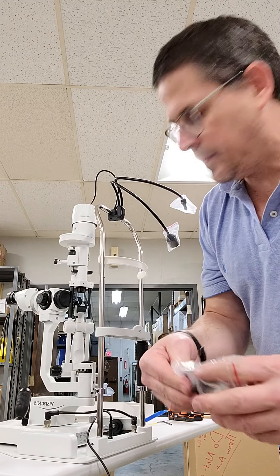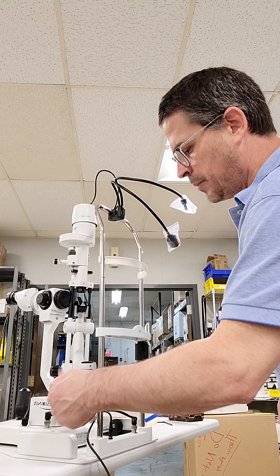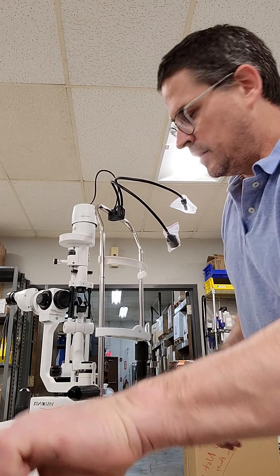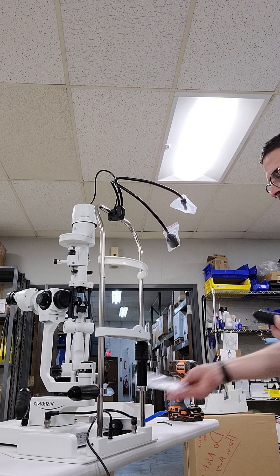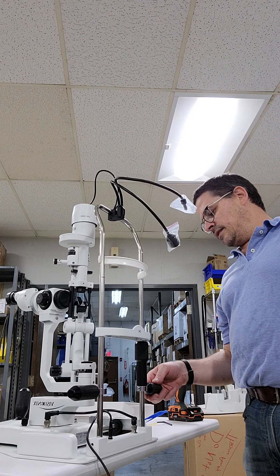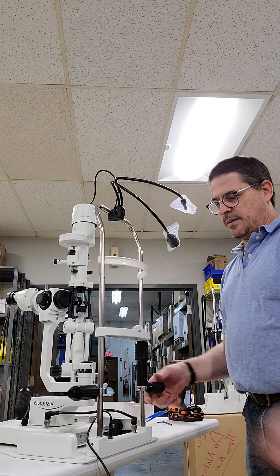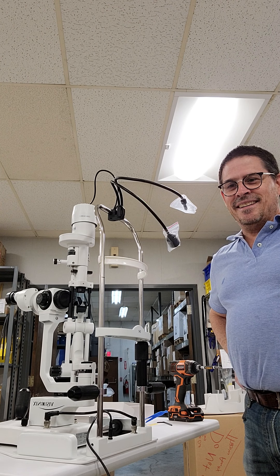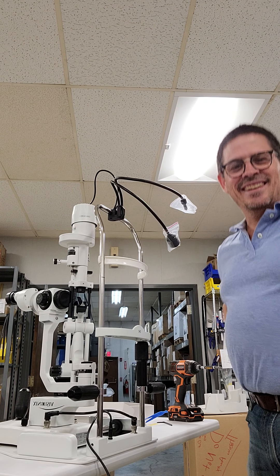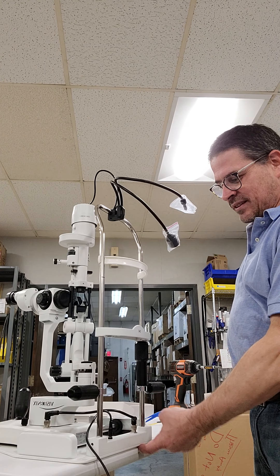Last but not least are the actual handles. These handles go on here — they're for the patient to hold when they come forward into the chin rest. I'm noticing I made a mistake here: this is on backwards, so it needs to be reversed. Now you've learned the right way. Just make sure you reverse this when you mount it to the plate.